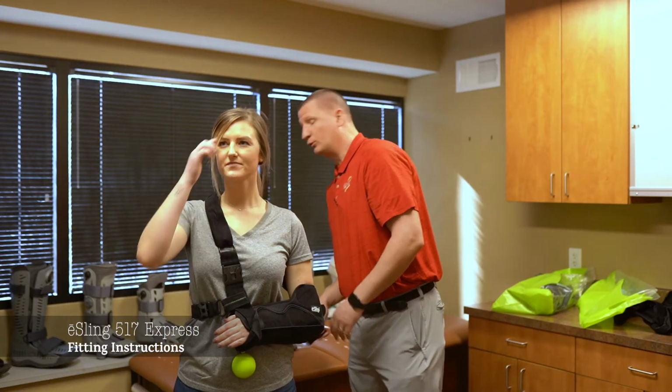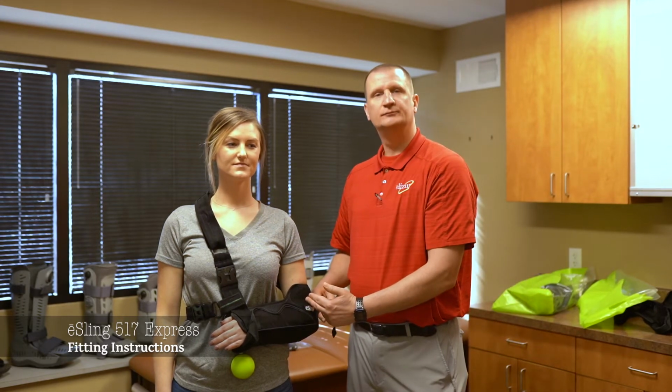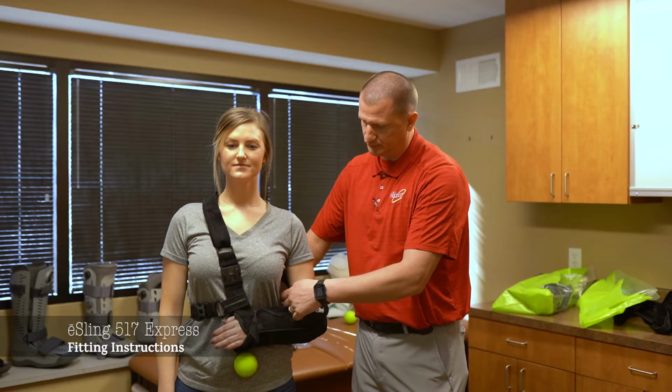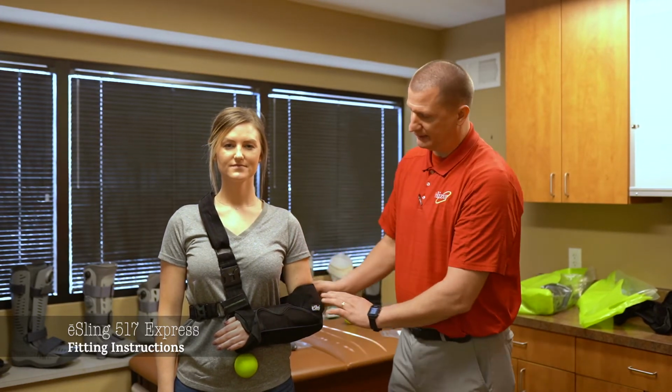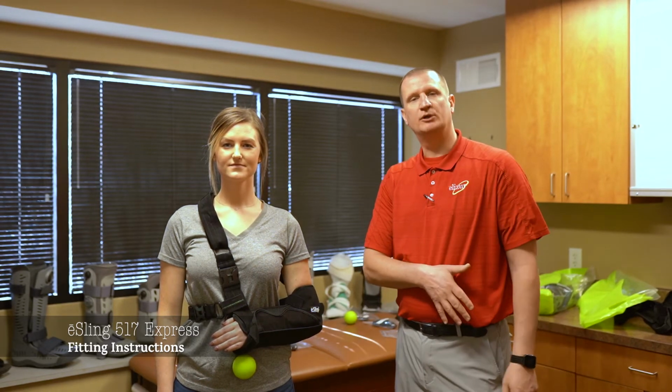And then we're going to find the correct length bicep strap to keep her elbow back. Positioning of this strap is usually in the front of the elbow, right here. Again, keeping the elbow back so the hand doesn't slide forward, and thus she gets what we call wrist drop.